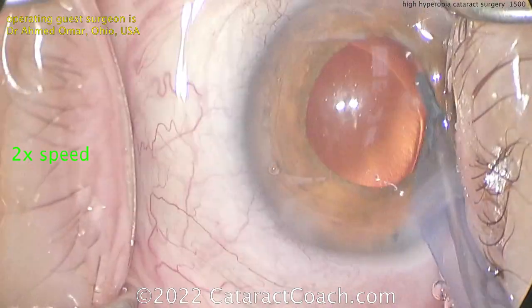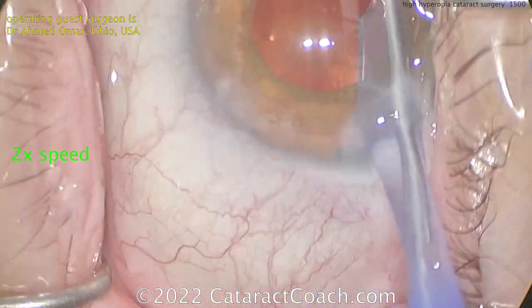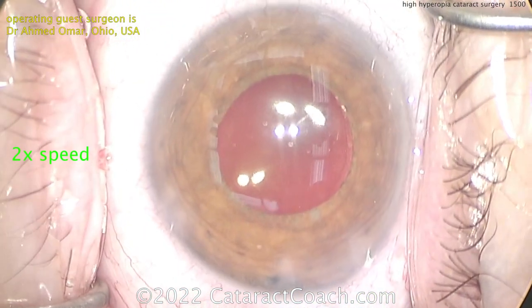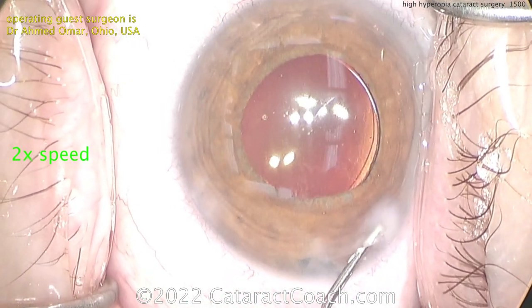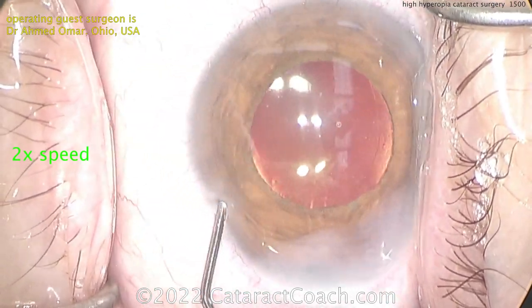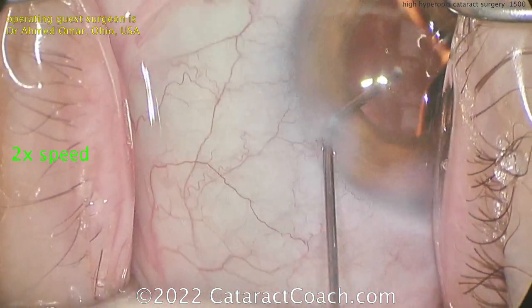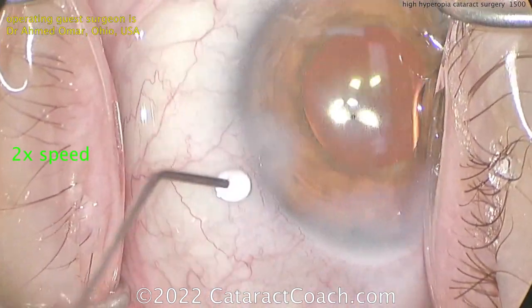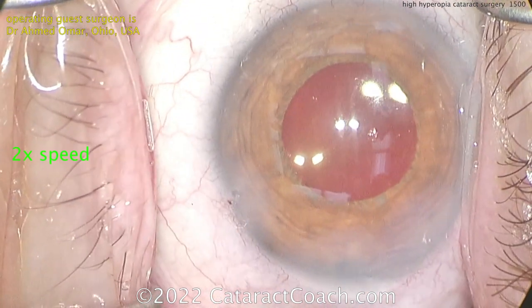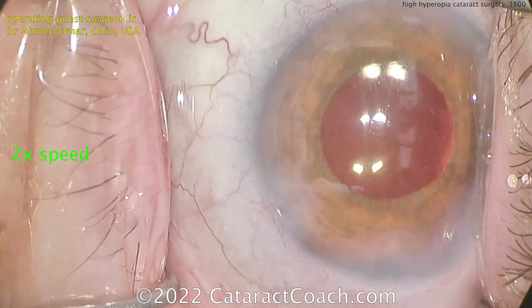In the USA, the highest power single-piece acrylic lens available is about a 40 diopter lens. Anything above that is not readily available and generally not FDA approved. So you may have to put in the maximum power 40 diopter lens, let the patient heal up, and if needed, go back and do a piggyback lens later. Hydrating the main incision at the end of the case — this patient is going to be very happy. Thank you, Dr. Omar, for submitting the video and for using iolcalc.com, which is totally free and a very accurate way of doing IOL calculations. Thank you for supporting CataractCoach.com and celebrating cataract surgery video number 1,500, every day in a row.